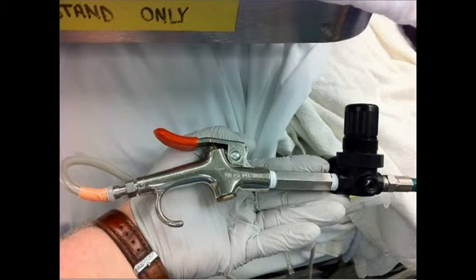With wear and tear over the months, the plastic pipe where it meets the Sander's injector can sometimes develop cracks which cause a leak. These can sometimes appear actually during a case and may well need emergency repairs on the fly while a case is being done. Orange tape can be most useful to temporarily prevent the leak in these situations.